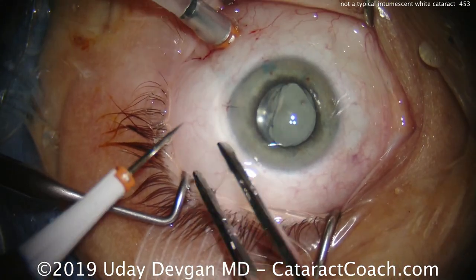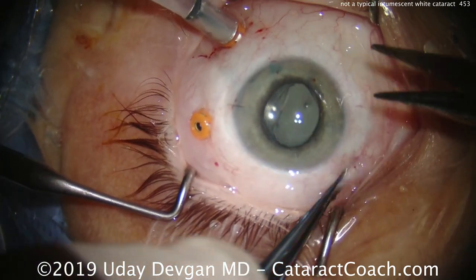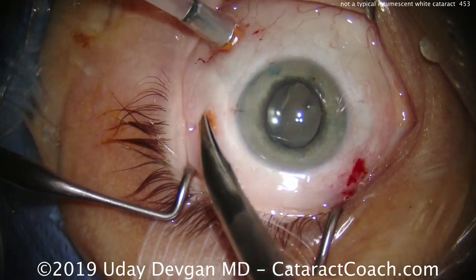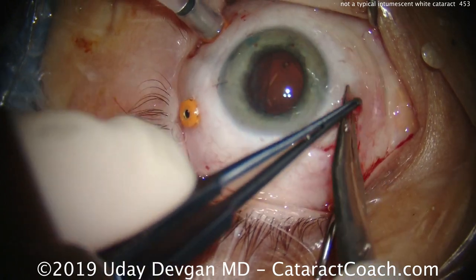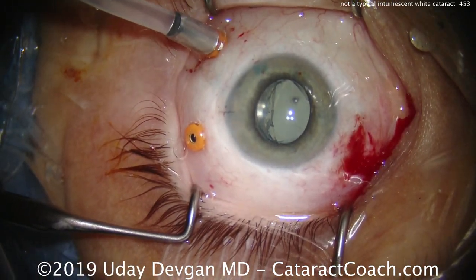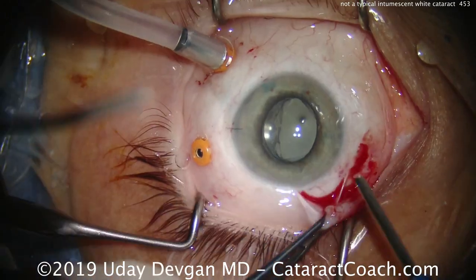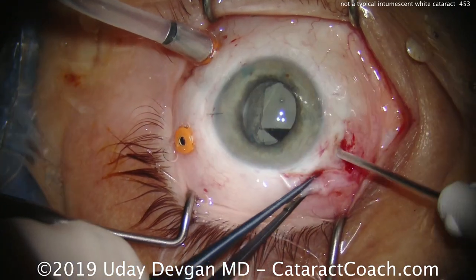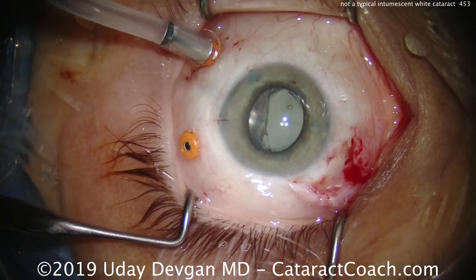My retina colleague is going to go ahead and place the infusion line and place another trocar. He's cutting the conjunctiva open and being prepared in case he needs to place that larger gauge fragmatome in order to break up the lens. He's done a little cautery and made an opening, cleaning that up and getting hemostasis.